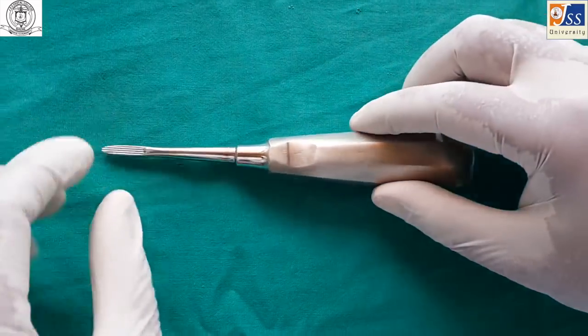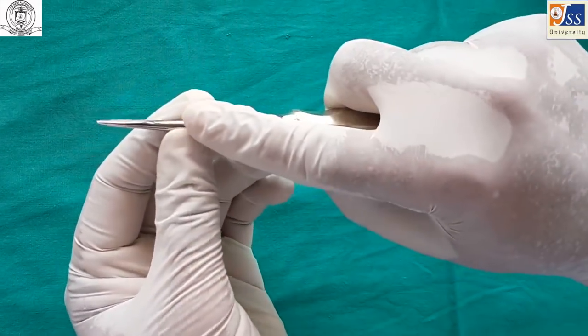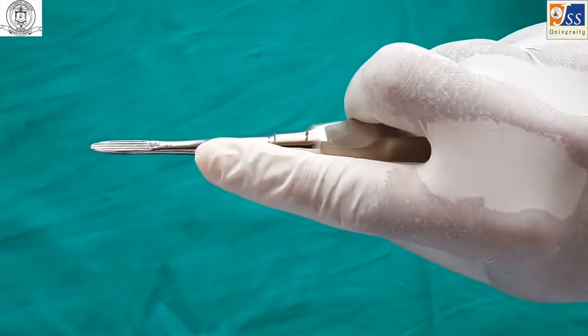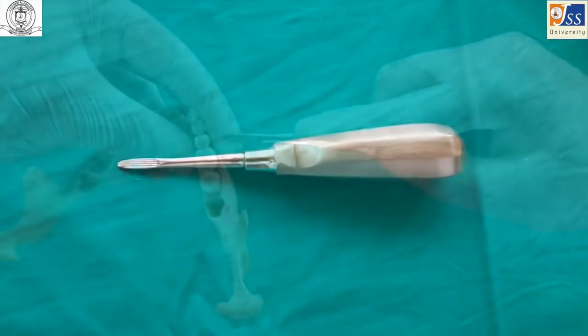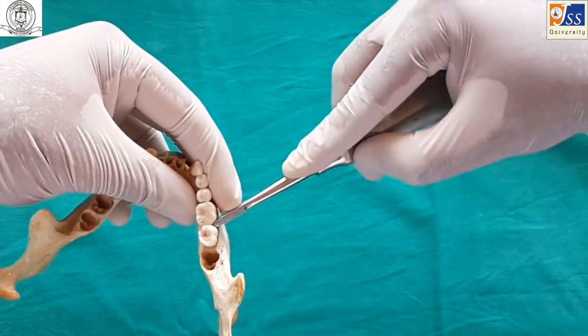The straight elevator is held in a palm and thumb grasp with a pointing forefinger. It is usually used on the lever and fulcrum principle.